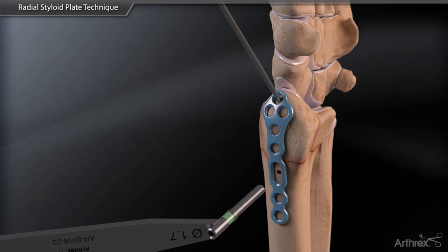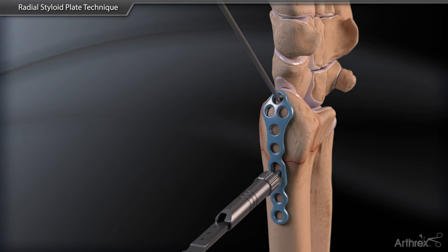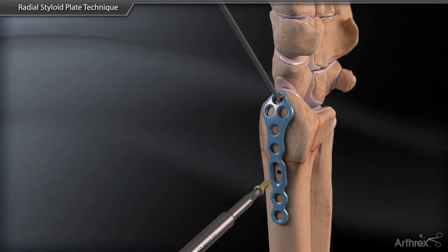Once initial position and reduction is confirmed under fluoroscopy, a non-locking 2.4mm cortex screw is placed in the oblong slot to contour the plate to bone.